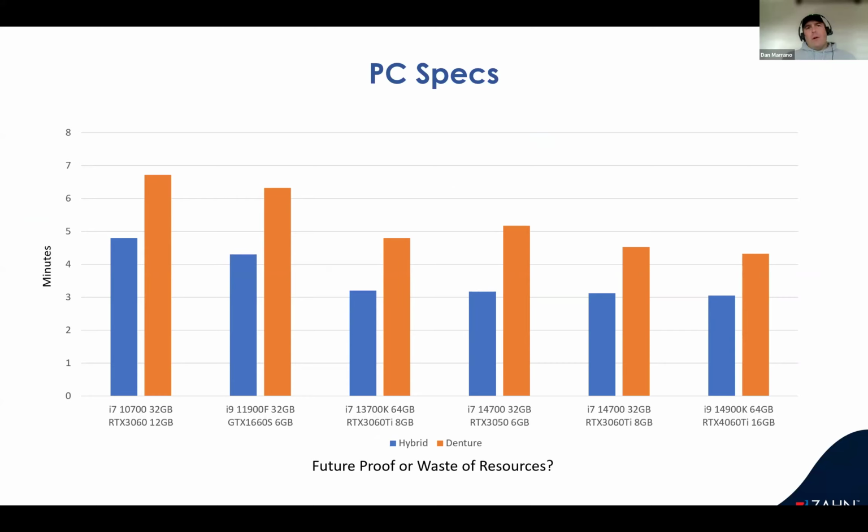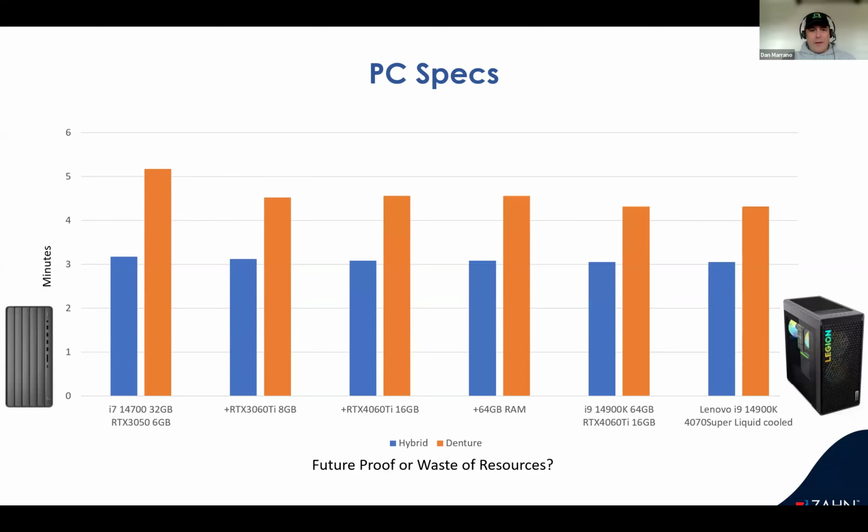And someone recently put online, are you going to get the best computer you could possibly get? You're going to future-proof yourself. Well, NVIDIA and everybody else has bigger and better ideas than that. They just came out with 5 series cards. I'm leaning towards, as I did this, that it's a waste of resources. A lot of these computers are taking a lot more wattage and amps and draw on your electrical, so you've got to keep that in mind as you're plugging all this stuff in.